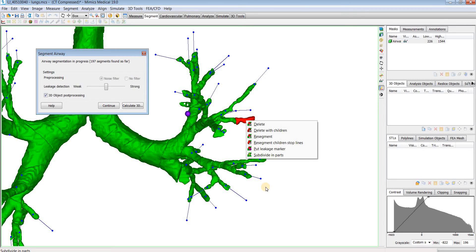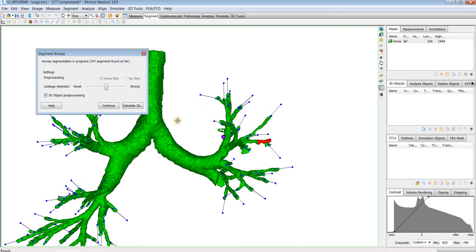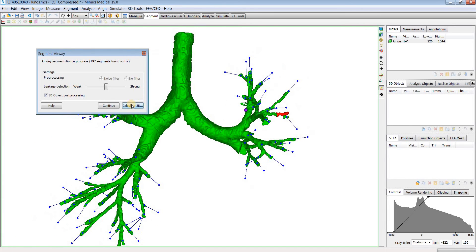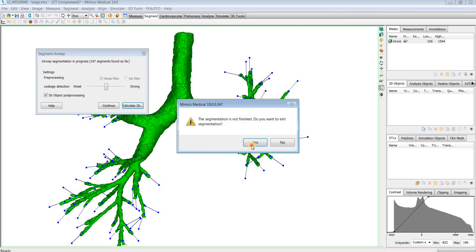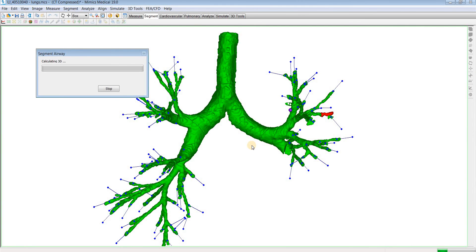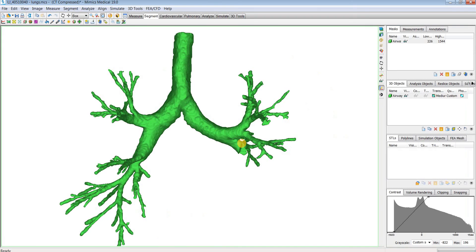Once you've blocked off any leakages with markers and deleted any branches you'd like to, you can go ahead and hit Calculate 3D. It's going to take that segmentation and calculate a 3D object for you. Once that's done, you'll see a 3D object of your airway, which you can treat like any other 3D object — you can hollow it out or export an STL. Many people will also want to fit a centerline to this airway and do centerline measurements.